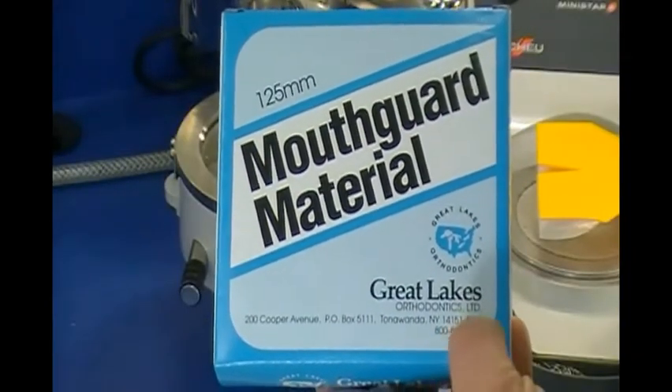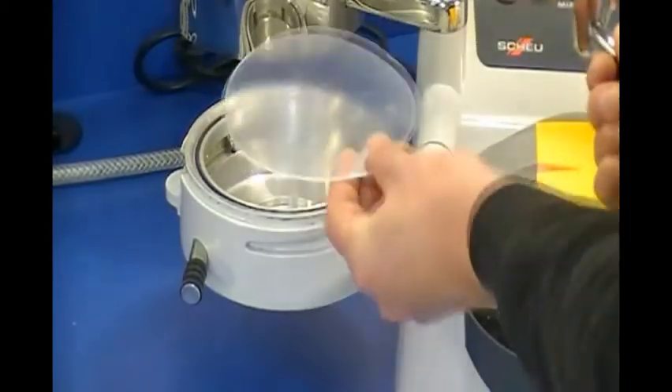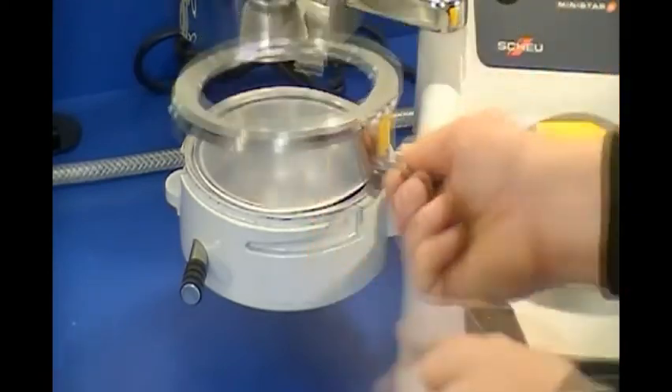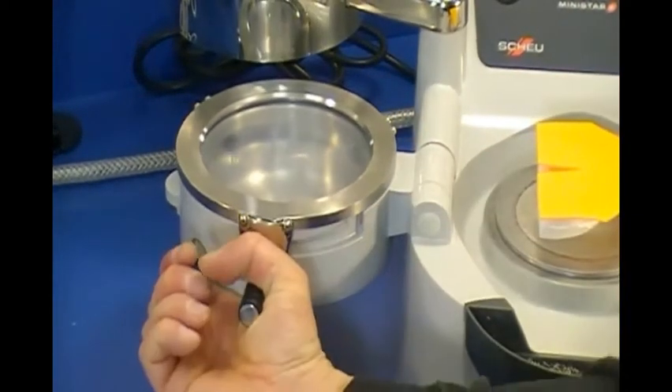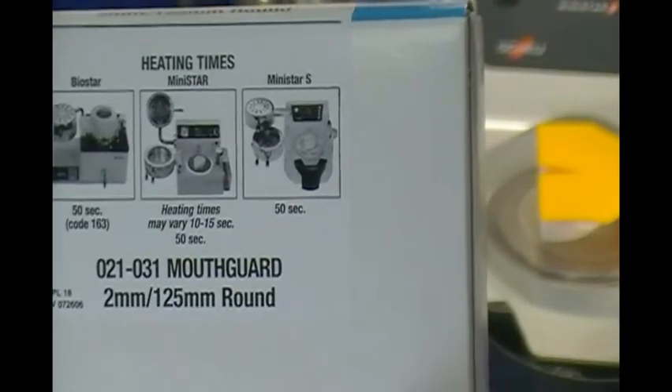A 2 or 3mm thick clear mouth guard material is clamped onto the pressure chamber. Identify the material's heating time or BioStar code and enter it into the machine.